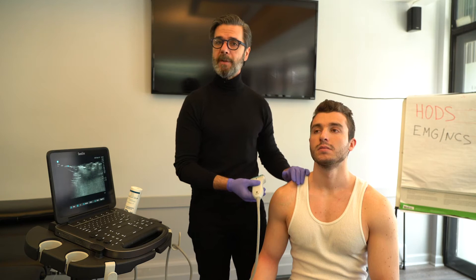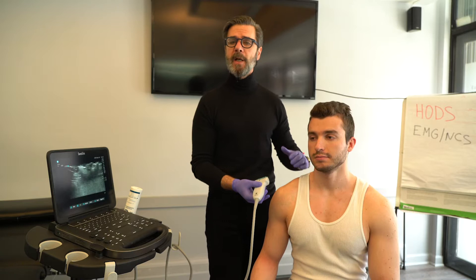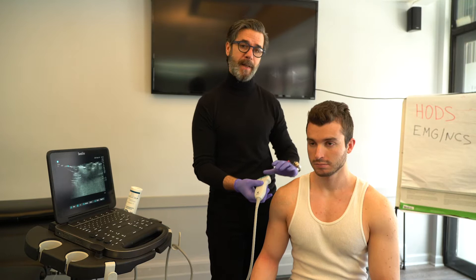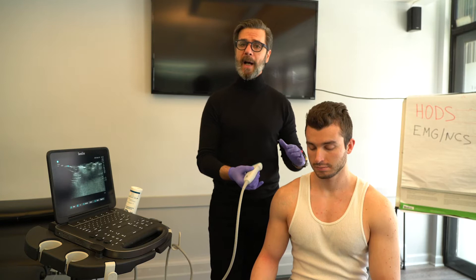I'm going to take you through a brief shoulder application of MSK ultrasound and show you what we're looking for. When a patient comes in with shoulder pain, you can pinpoint or rule out that there is no problem with the shoulder — it could be something else. Shoulder pain can be caused by the neck, the first rib, or other parts of the body that refer pain to the shoulder. It's an awesome tool to see inside the body and identify the problem.